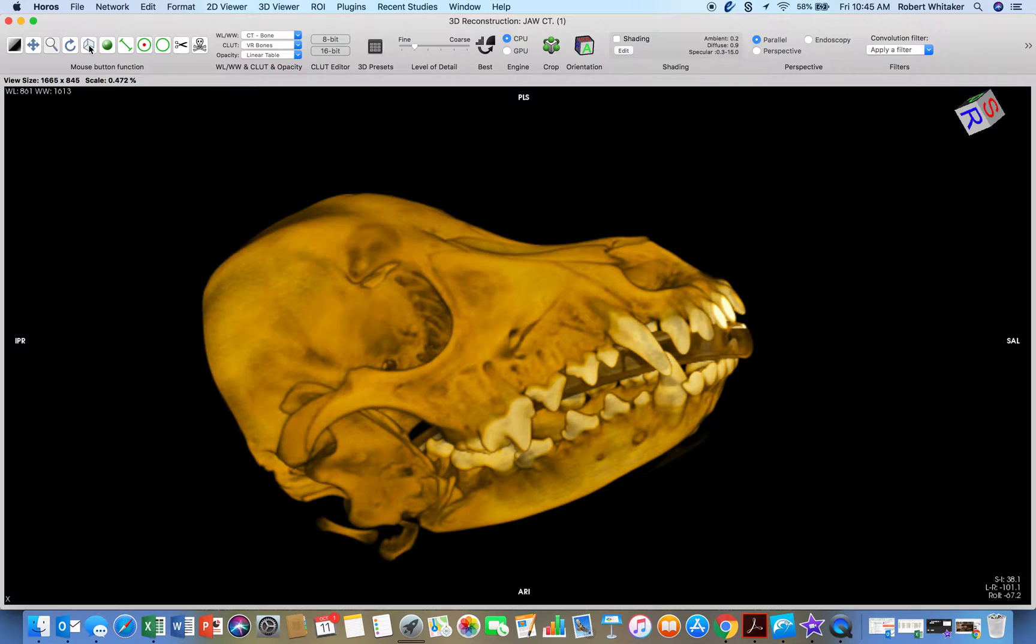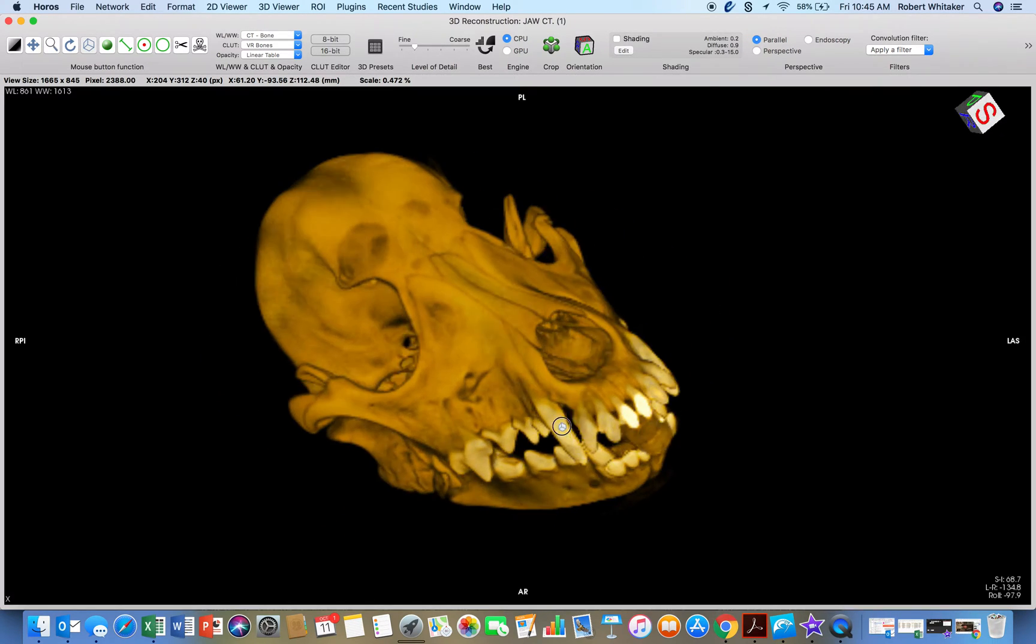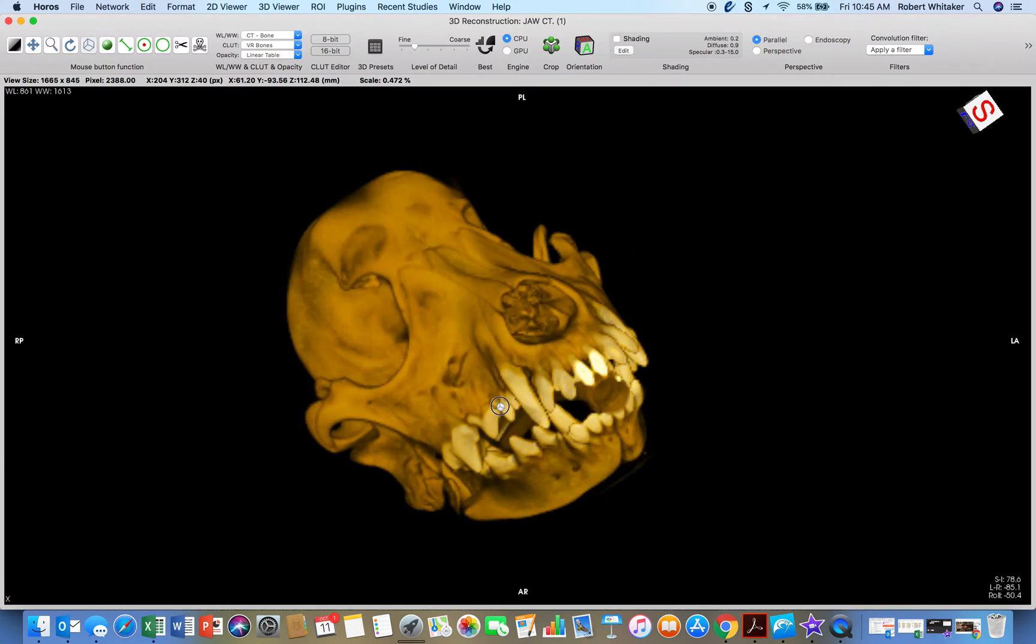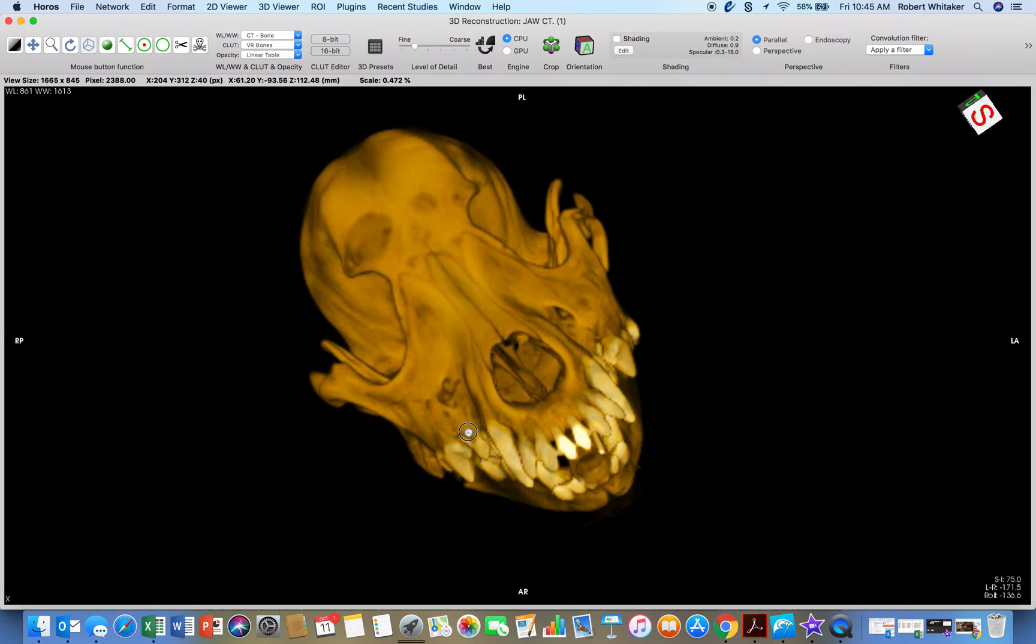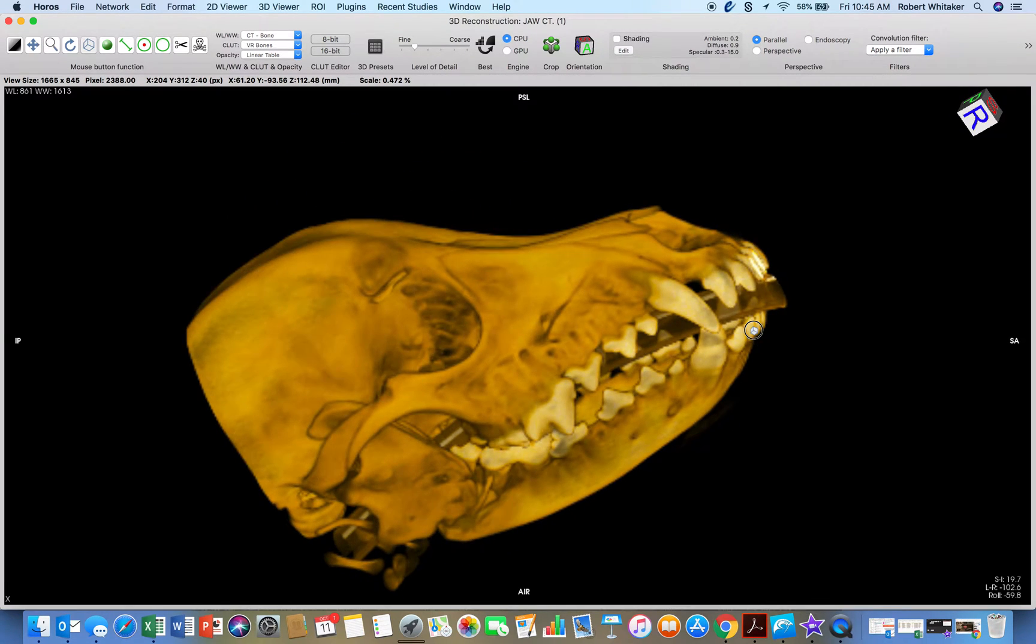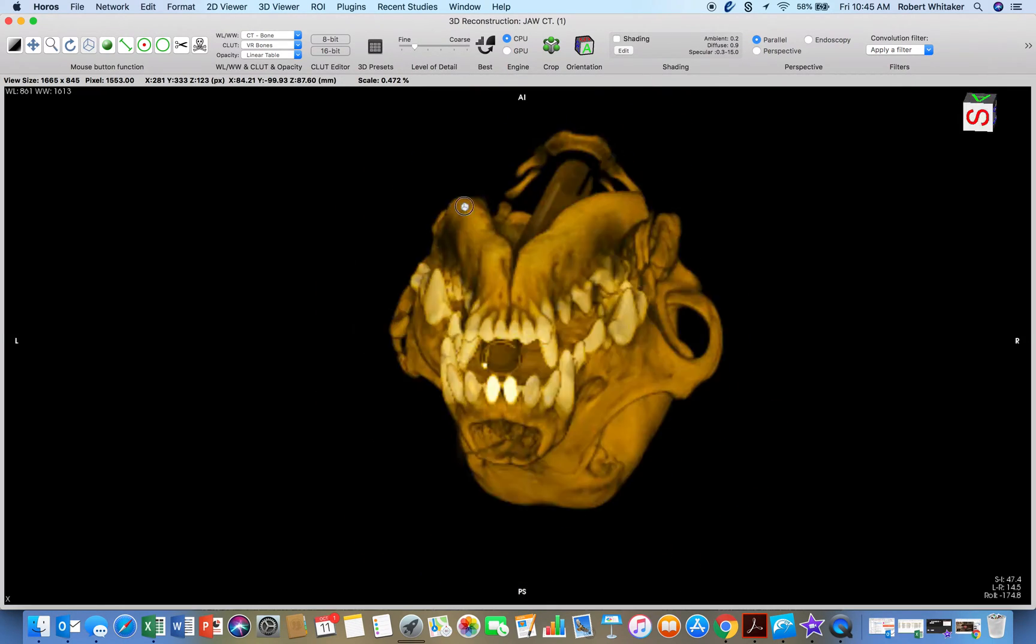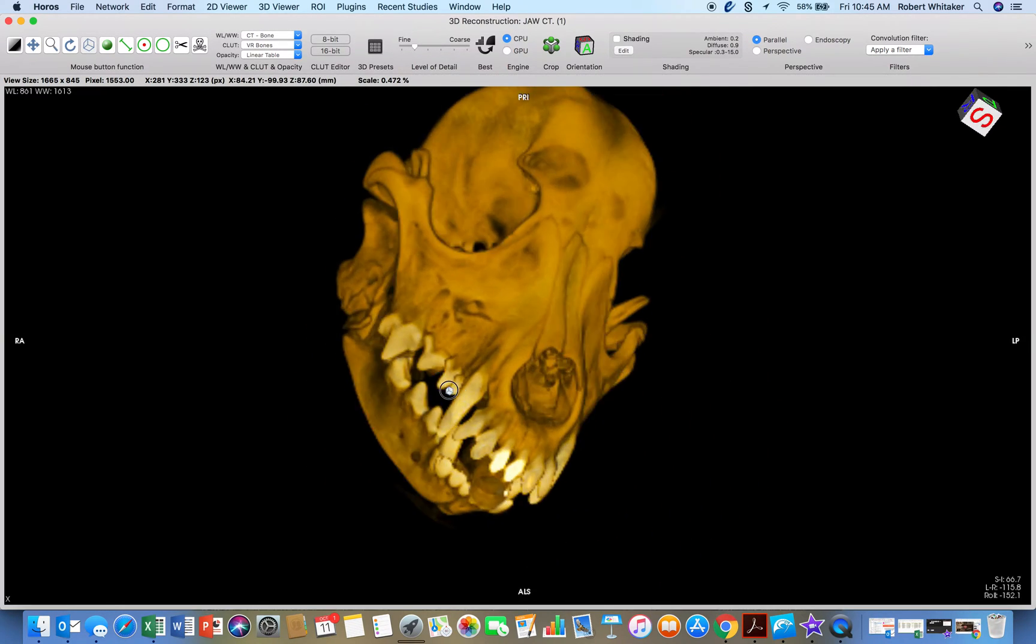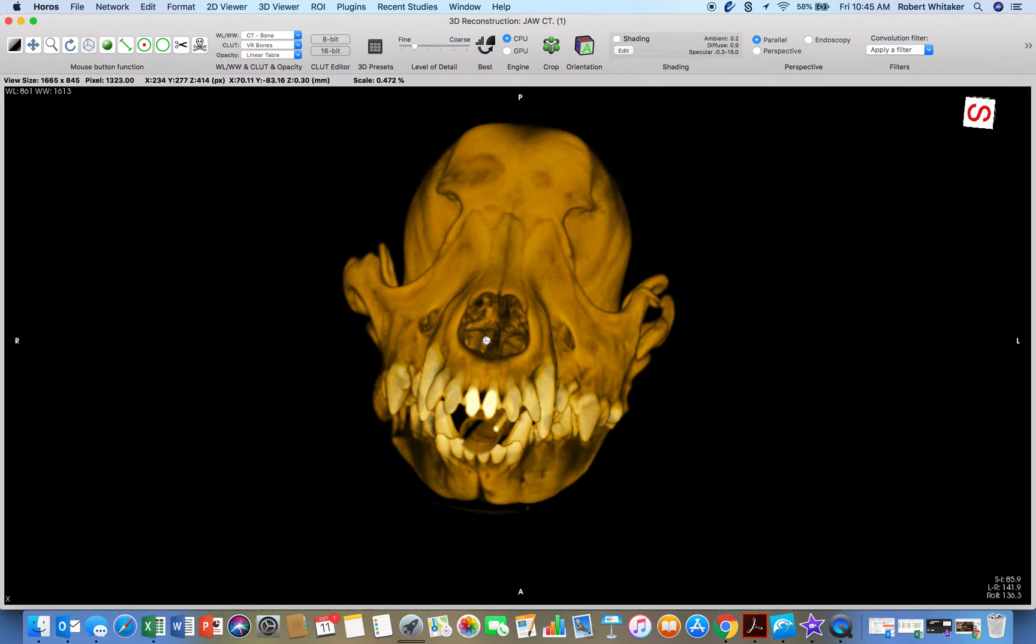I want to move the 3D image. I click this cube, left click hold, and then rotate, just pulling your mouse across the screen or pushing it up. And sometimes you have to do circles to make it straight.